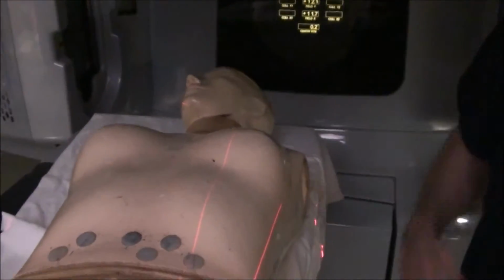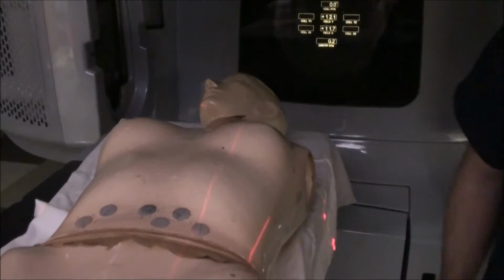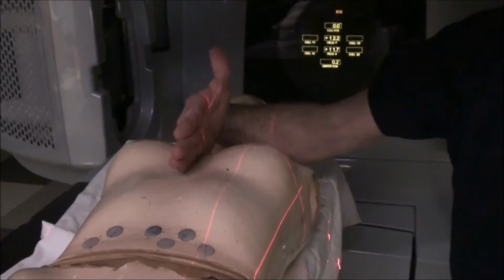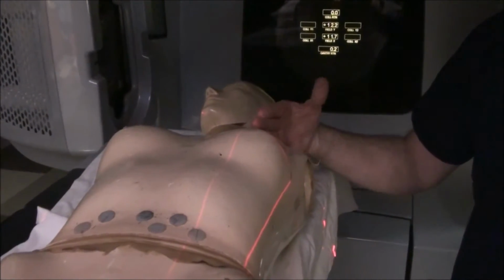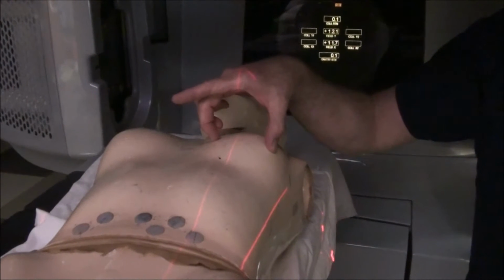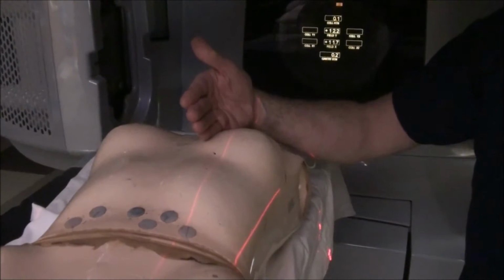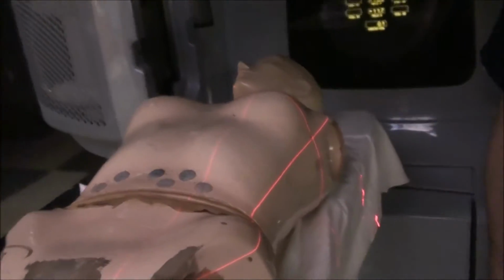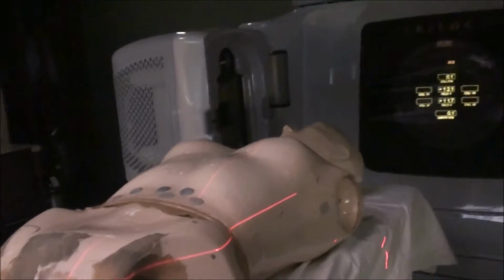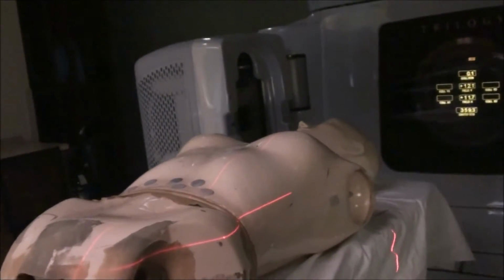It could be laying off over here. It could be perky like hers. It could look like her chest. But you want halfway between the midline and the lateral flash and have that laser just cut right through there. And once again, two equal parts. So essentially you've quartered her breast area. 1, 2, 3, 4 quarters. Now that you have the patient ballparked, you're going to rotate the gantry off about 45 degrees.